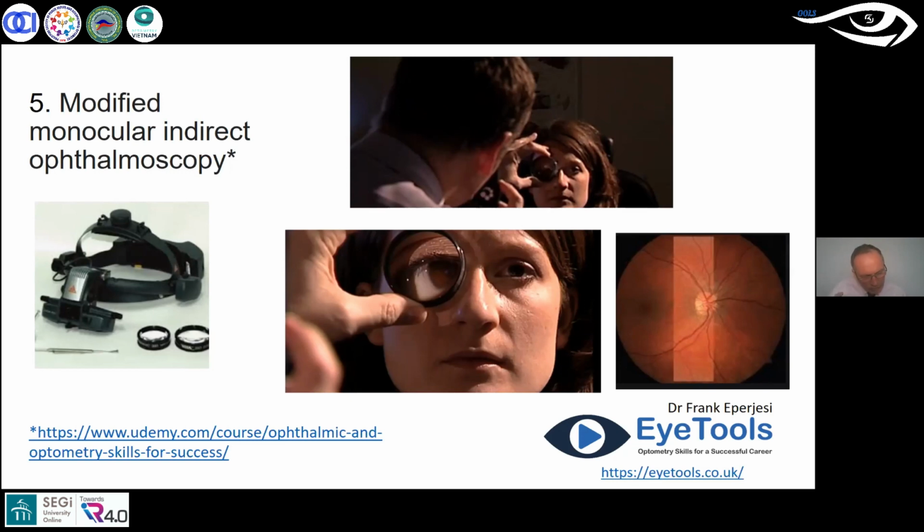You can get closer, or you can move further back to enhance your view of that image a little bit, rocking backwards and forwards. But I find about 18 centimeters away from the patient with the right lens focused in will give me a really good image.